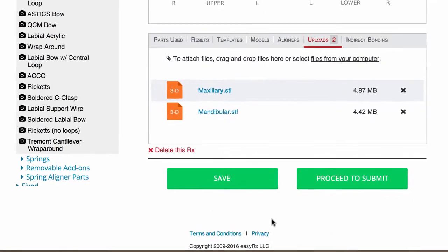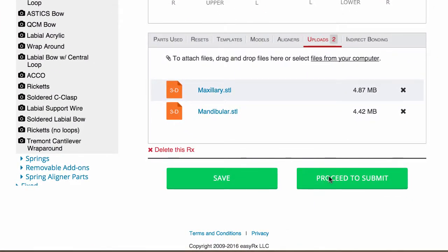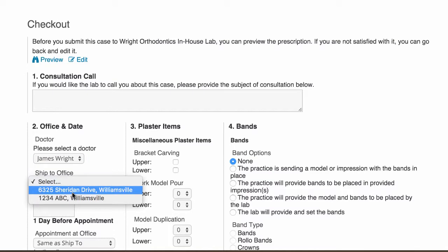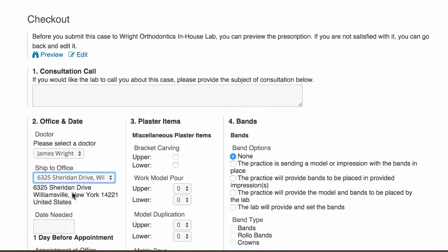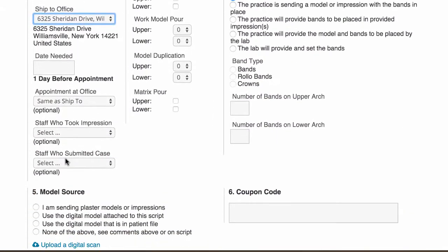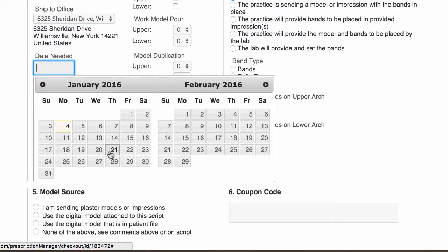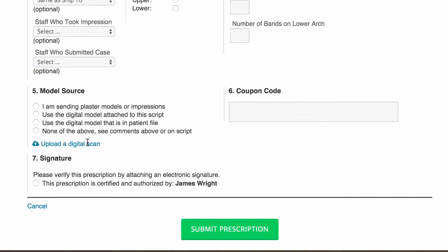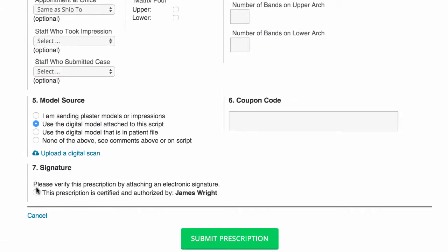To finish, either save your prescription to complete later or click proceed to submit. On the checkout page, select the doctor and the location where the patient's appointment is, and choose a due date. If you've added your clinical staff into EasyRx, you can choose who took the impression and submitted the case. Choose the model source, click the signature, and submit.